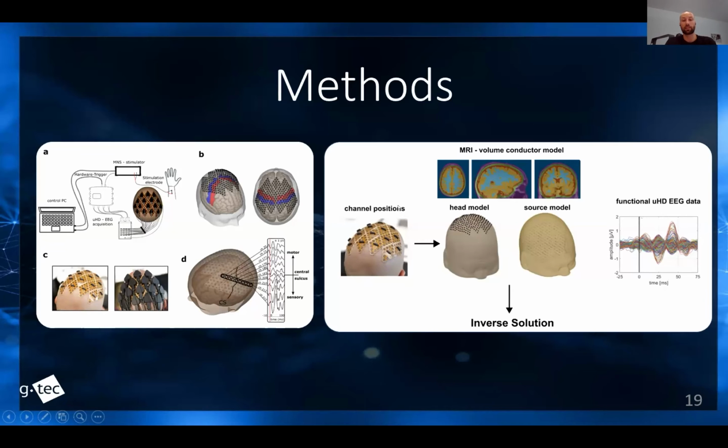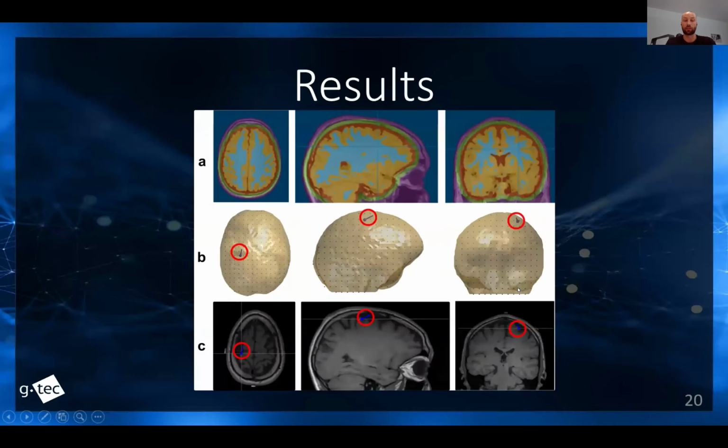And we use that time-locked SEP information and the electrode positions and the MRI to build the volume conductor model. And with that, we then created the inverse solution.